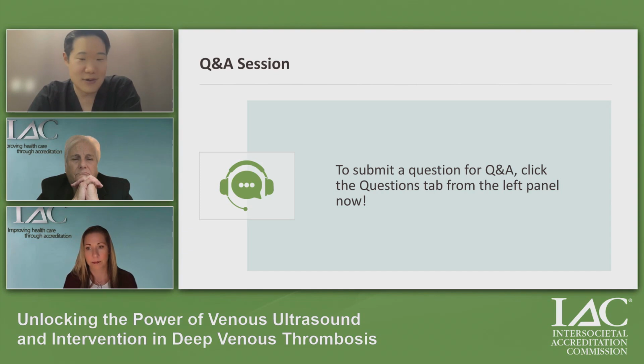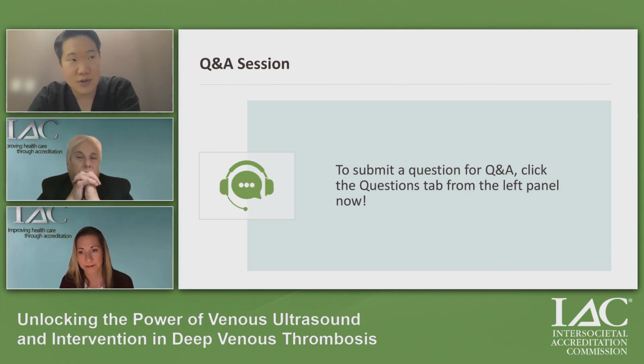So whereas you can always find a story of someone who had a struggle, generally speaking, my principle is this, and I don't think this was on my slides, but another point to remember: your devices carry some risk, of course. But if you leave thrombus in the vein, as we talked about, the thrombus can age and it can become that chronic problem and chronic issue for that patient, maybe even chronically debilitating. Leaving the thrombus in there, in my opinion, is a higher risk than trying to take it out with any of these kind of validated technologies.